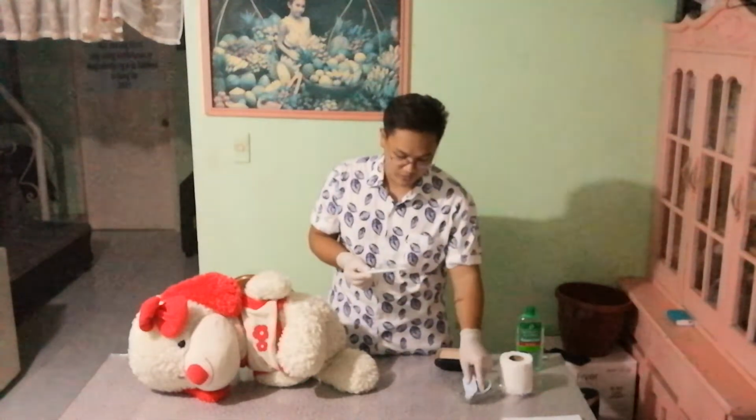So our fourth step is we need to lubricate about 1 inch of the probe.